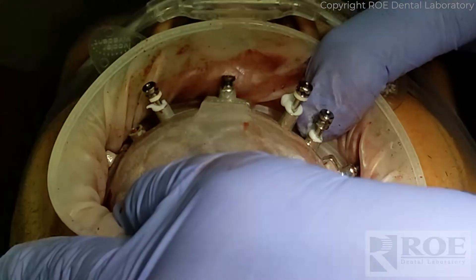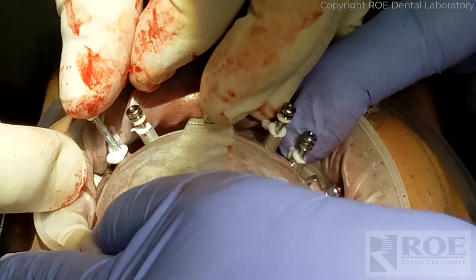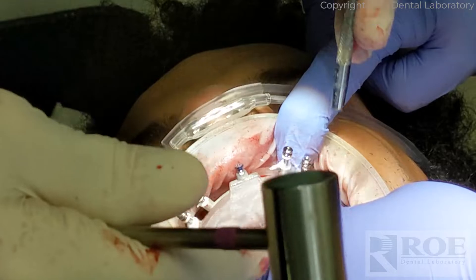If the first pin is seated and hammered, the guide will move and accuracy is lost. Many doctors have started using Neosporin on the chrome pins. This provides better hygiene and allows the pins to slide into the fixation base easier.